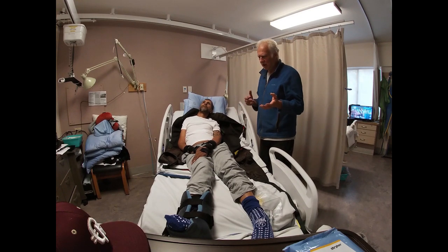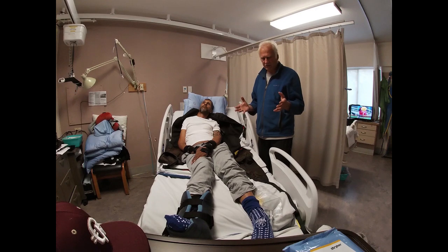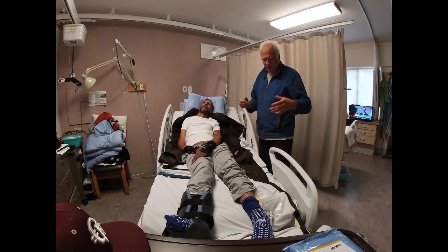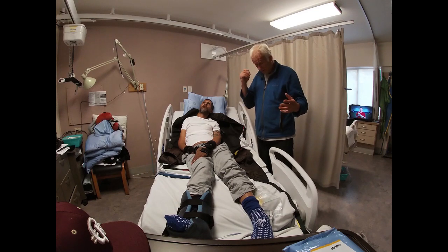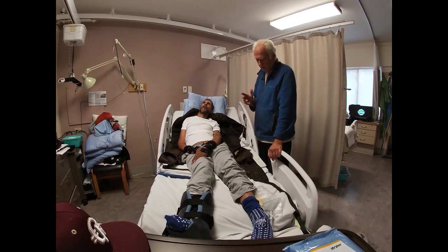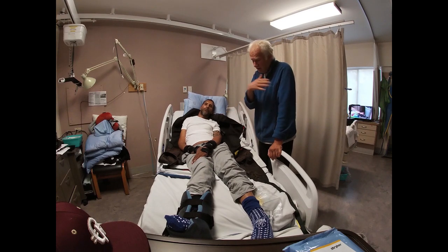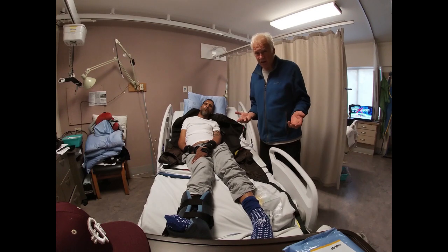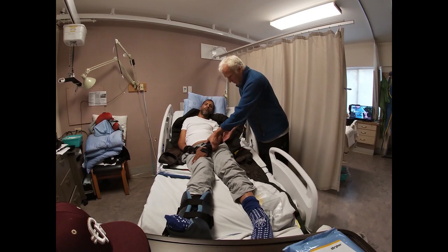If you wanted to look at an example, it would be the mirror box that is used for phantom pain in an amputee, where the phantom limb is put beside the box and your other hand is working, then it might look like the phantom limb is actually working, and that way the pain goes away. So it's distracting the mind from the amount of spasm in this case. There's no paperwork, nothing written about it, but I just thought I would try it, and it seemed to work. This is the second time that this has worked. There was another client earlier that had the same kind of thing.